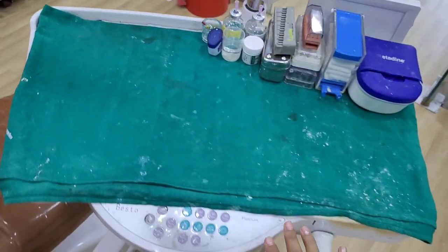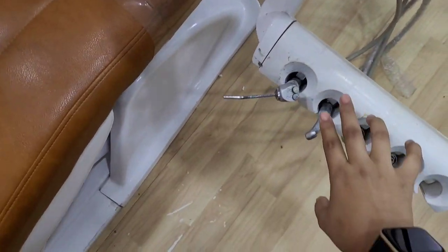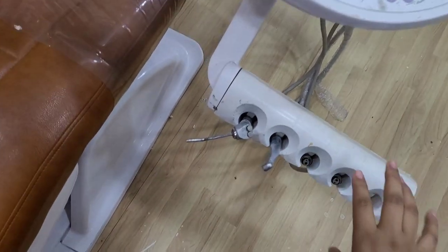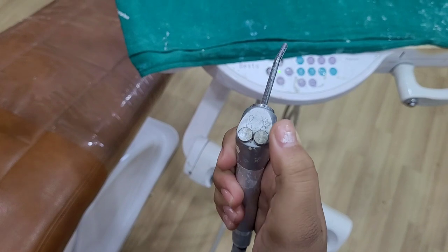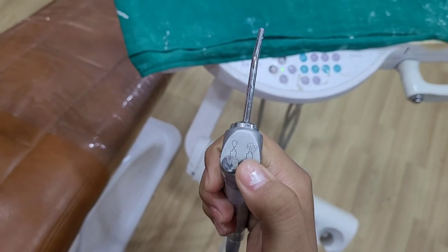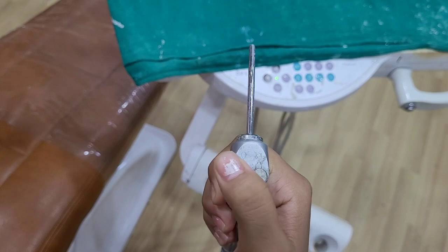So this is the trolley. Here are the buttons. This is the air rotor and this is the 3-way syringe. This is the tip of the 3-way. Here, the right one is air and the left one is water.